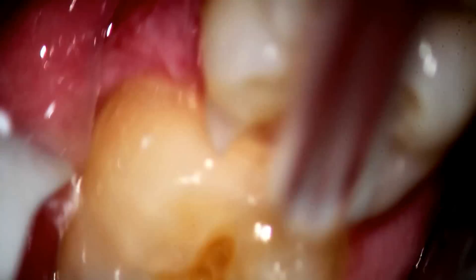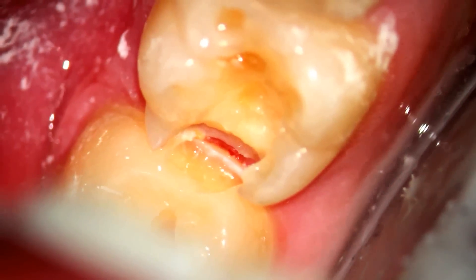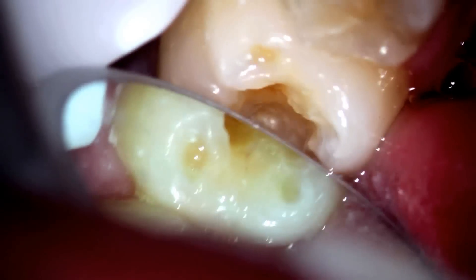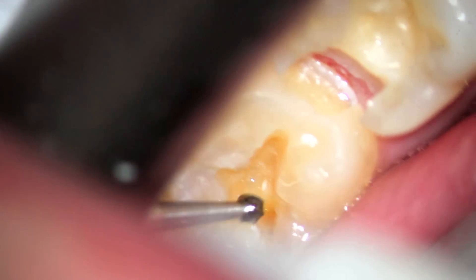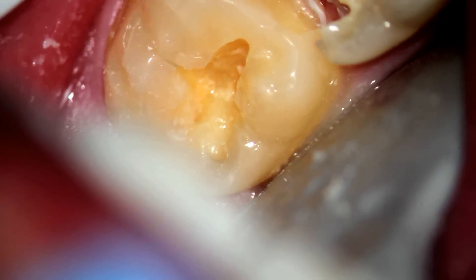In a few minutes I will start removing that in a very conservative way. Because I have access to the side of the tooth, I can go ahead and just remove that portion of it. As we get closer, you'll notice that behind the white area there's a little bit of brown decay where the bacteria had penetrated. The drill I'm using is called a 330 — it's a very small head. Now we're going to switch to a round burr that is able to remove some of the composite that's still there and to remove the obvious decay.